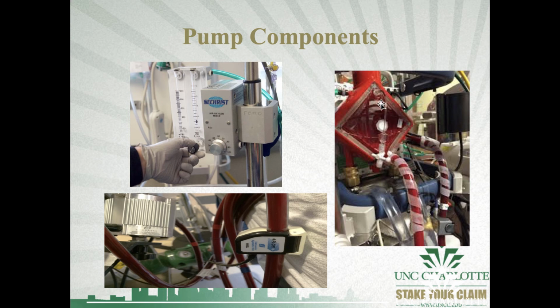And we can develop some fibrin shredding and clots, and that will subsequently lead to oxygenator failure. We measure pressures on our venous side and arterial side, and through our manifolds and everything else over here. But you see right here, this is our circuitry. So this is our venous blood coming back, or deoxygenated blood coming back to our system. It's going to go through our centrifugal pump and then out our oxygenator and back to the patient as bright red, nicely oxygenated blood.